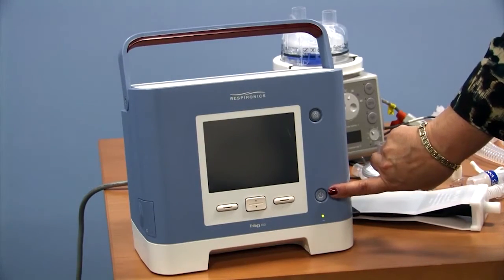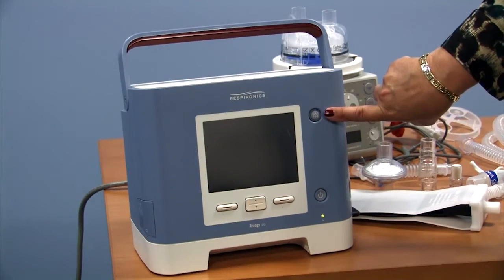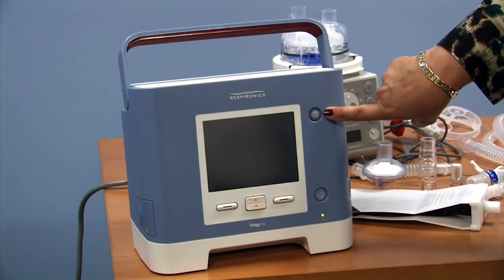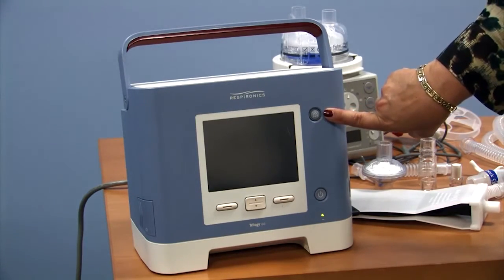This is the main power button here. This is the alarm silence button. And this button will show you both yellow and red. Yellow indicates a low priority alarm, and red indicates a high priority alarm. They sound different as well, and we'll get into that in a little while.